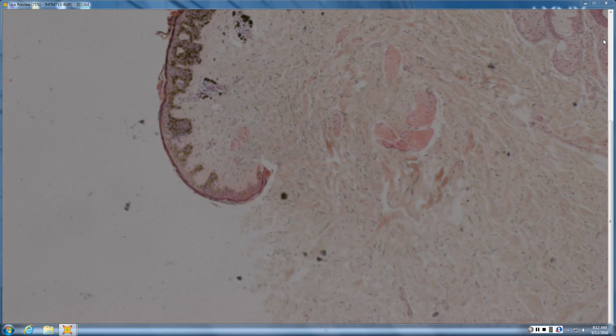So you have a pretty small lesion. It's like they got around it with the punch biopsy. A lot of hyperpigmentation, not really confined to the basilar layer, and then you have some melanophages. They're scattered around the vessels, and also some in the stratum corneum. So probably this was a redheaded person with a tiny little jet black lesion consistent with an ink spot lesion. Exactly. So it looks like an ink spot lentigo.